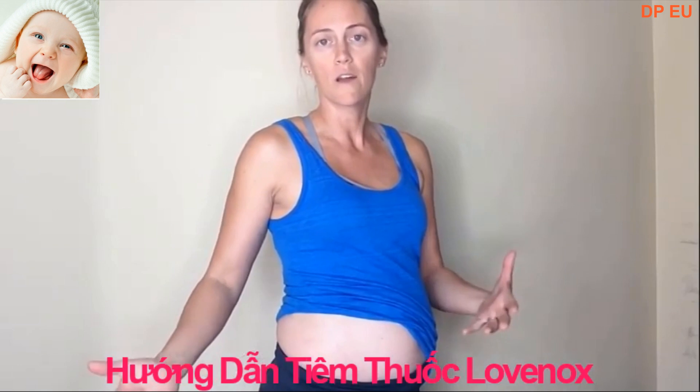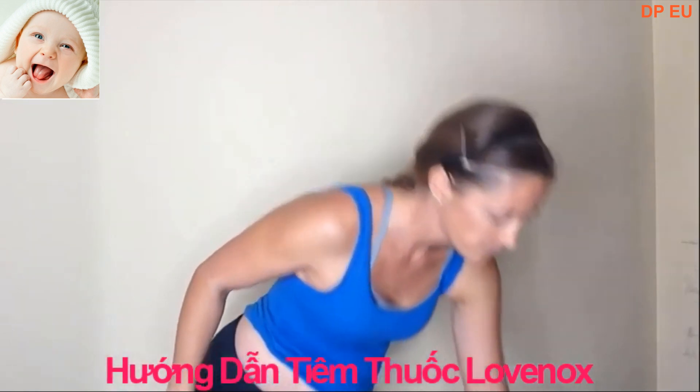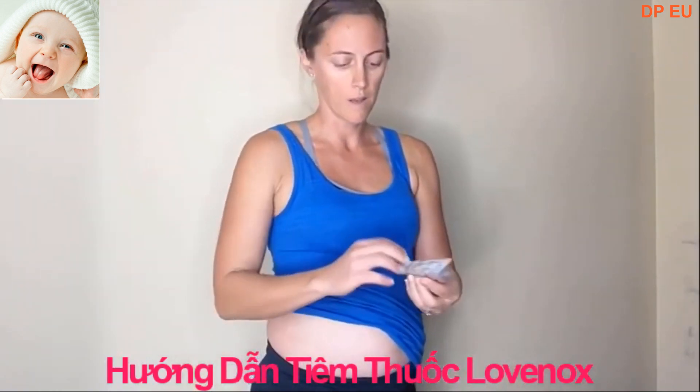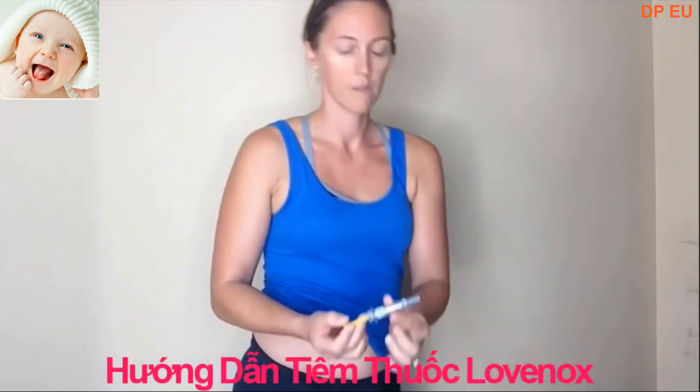And Lovenox, as it is, it can sting. So here is my pen. I'm going to go ahead and open it up. This is my Lovenox injection.